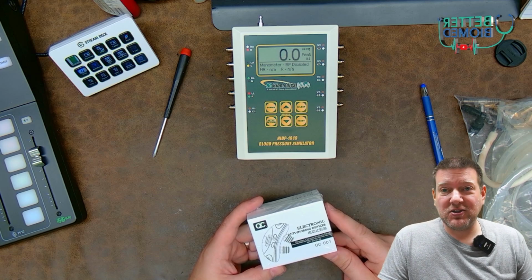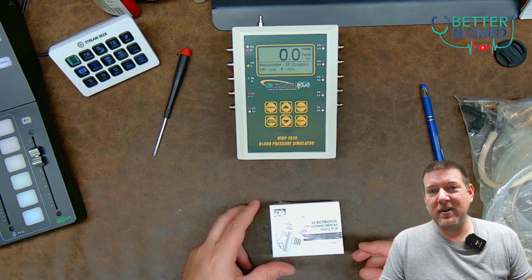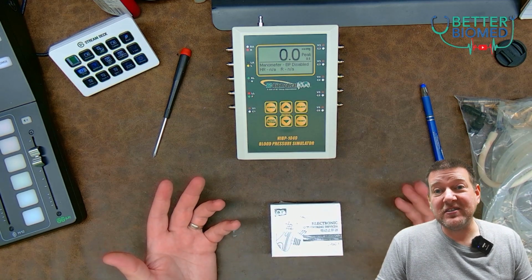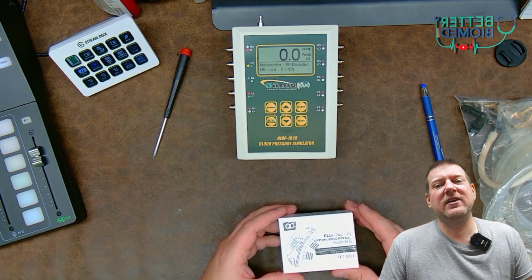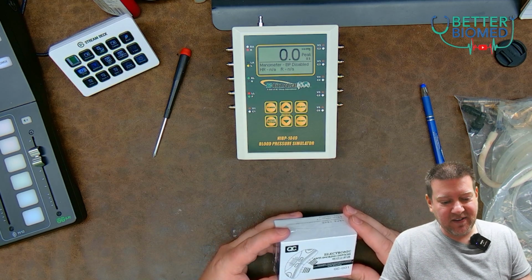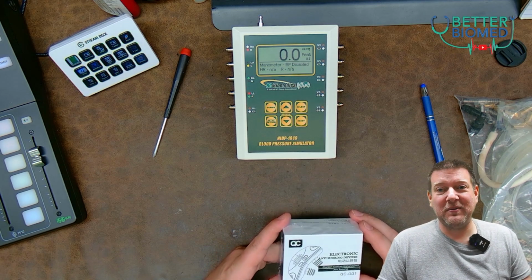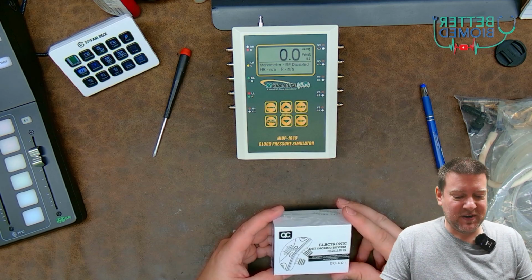An oxygen concentrator uses a membrane to separate oxygen molecules from regular 21% oxygen air. Thus, it concentrates the oxygen in one space up to about 70%. Now, if this guy even gave me a 1% increase, then I will eat my hat. But this guy here, it's almost guaranteed just to be a fan. I could be wrong. It might have some mumbo jumbo inside it that I've never heard of before. That would be fantastic. But what I think it is, is just a fan that plugs on your nose.